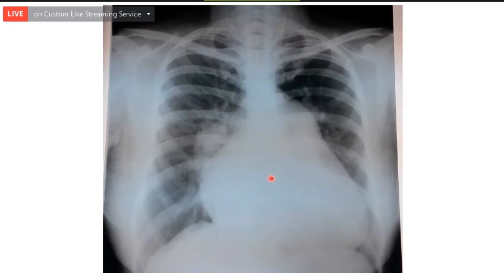In a lateral view, you have to draw a line from the lowermost part of the cardiac silhouette which touches the spine, touches the sternum. From that point, you draw a line to the hilum of the lung. Hilum of the lung. Yes, then. After that? So it will be, sir, below and behind, posterior. Now you have to describe it. Where are the chambers?